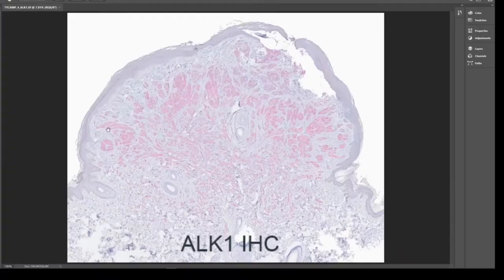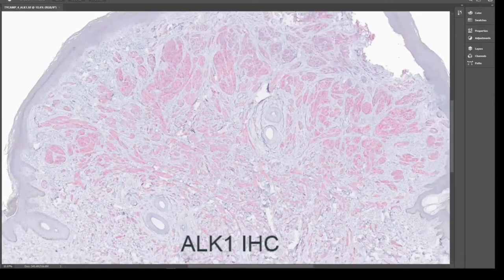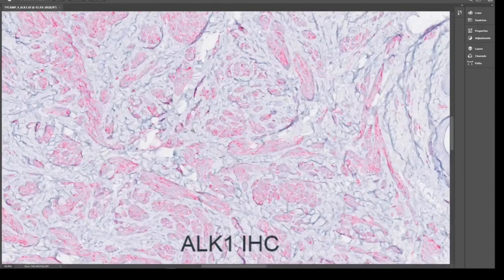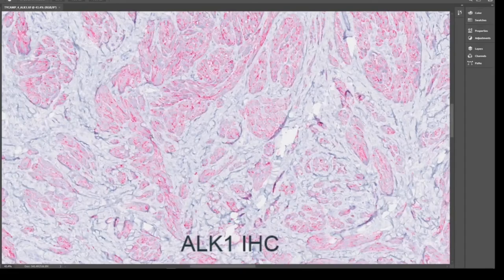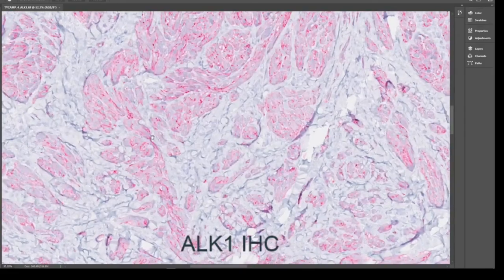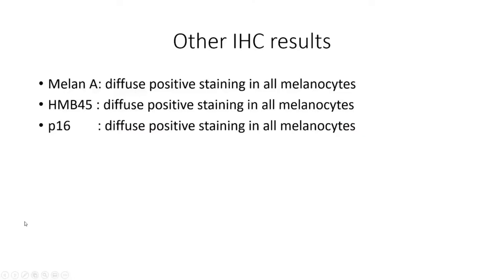This is the ALK1 IHC that underscores the fascicular architecture. If we zoom in, we see it is a granular cytoplasmic stain. Here are the other IHC results with the diffuse positivity of Melan-A, HMB45, and p16.